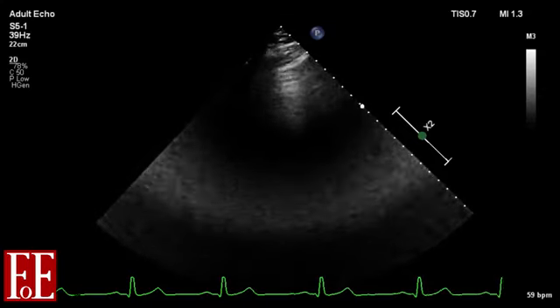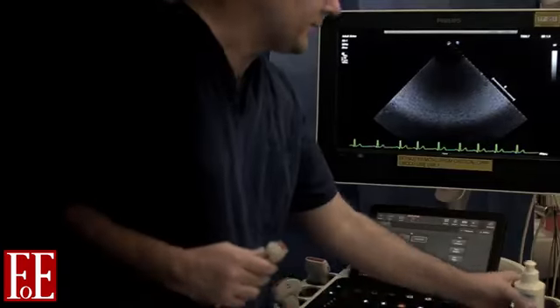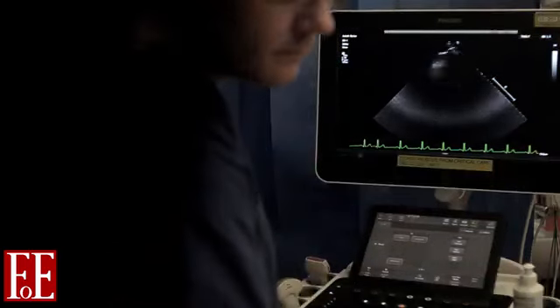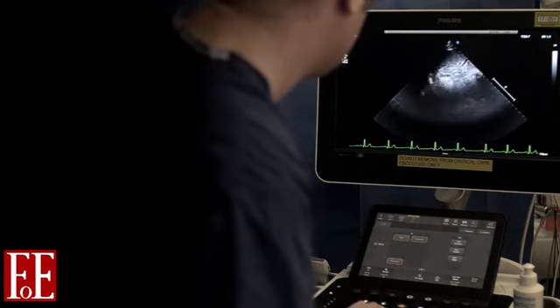And we're going to try and identify the medial portion of the diaphragm. We're going to try and follow the diaphragm over the liver. And we're going to try and visualise the lateral portion of the diaphragm. And most of the time we're going to fail to do that because there's going to be aerated lung and the costophrenic angle, but it's going to obliterate our view.